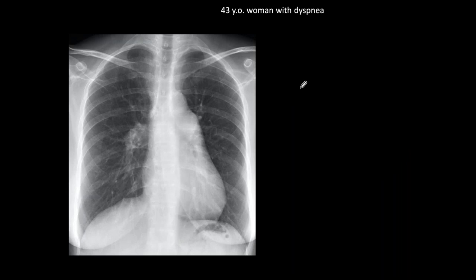We have a 43-year-old woman with dyspnea. At first glance the heart is a little enlarged, but the most important finding is an obvious convexity of the pulmonary artery arch, indicating dilatation of the main pulmonary artery. When we see that, we go and look at the hila. The right one is enlarged; the left one is hidden behind the pulmonary artery. We also look at the pulmonary vasculature — it is diminished, with no significantly enlarged vessels in the lower or upper lobes on either side.